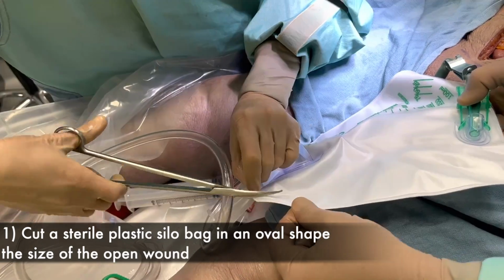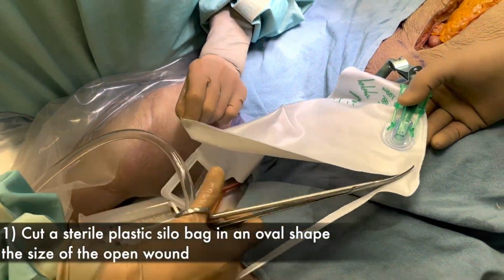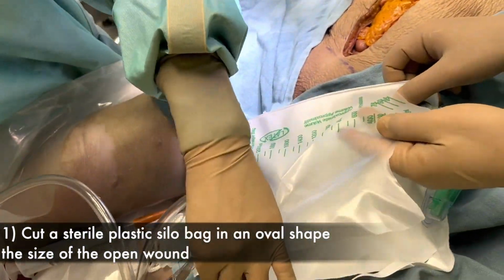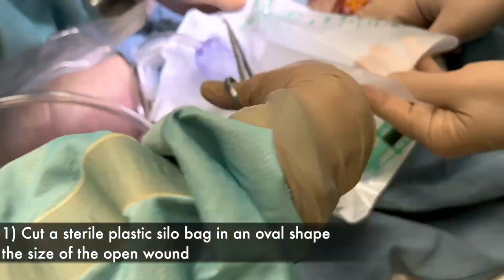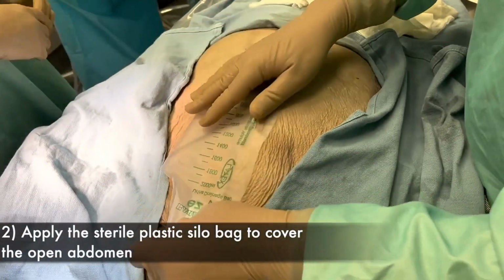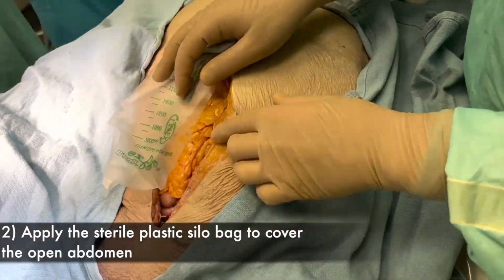To begin, obtain a sterilized plastic silo bag, also known as a Bogota bag. In this video, a urine drainage bag was used. Cut the bag using the Metzenbaum scissors to create a plastic sheet that will cover the exposed viscera. Apply the sterilized plastic bag to cover the entire open abdomen.